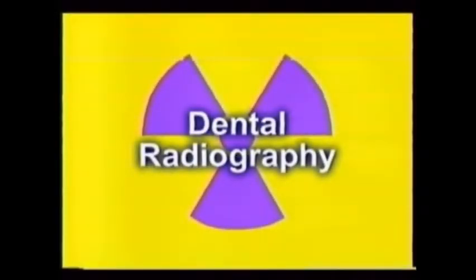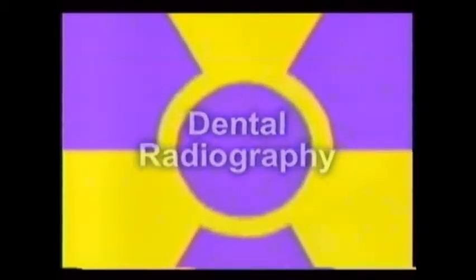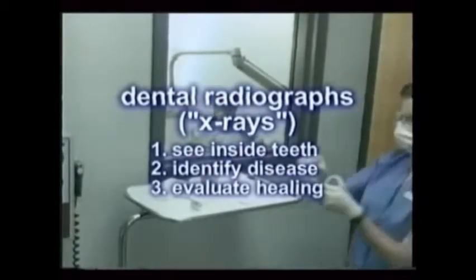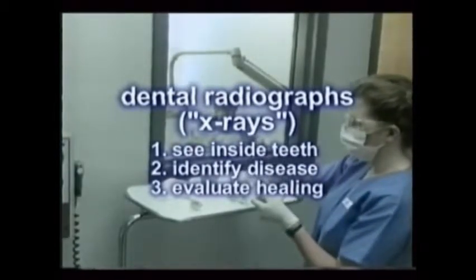X-rays are one of the least understood elements of dentistry, both by patients and even some staff members. Yet they're one of the most useful diagnostic tools the doctor has. Much like airline pilots use radar to see in the clouds and in the dark, X-rays allow us to see inside the teeth and bone structures, identify disease, and evaluate healing.